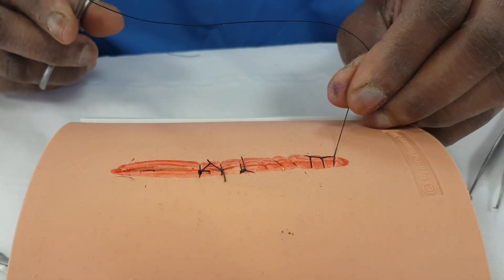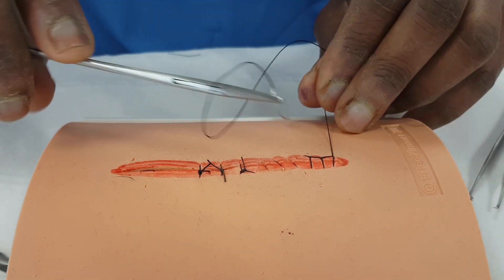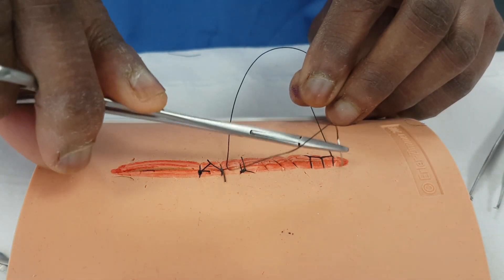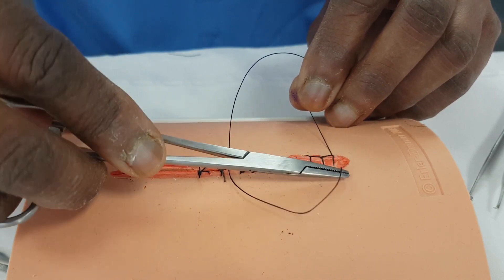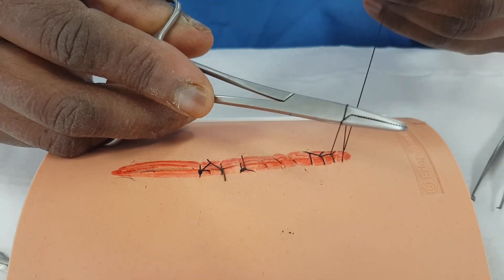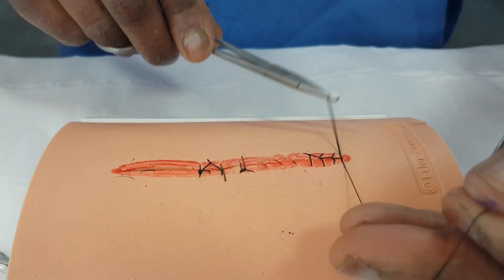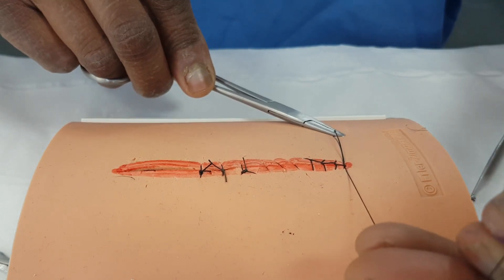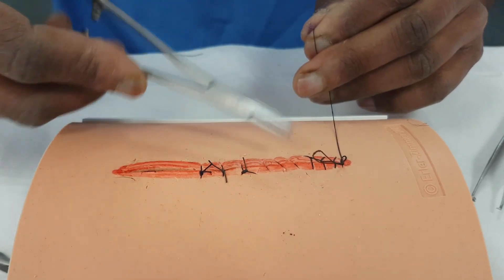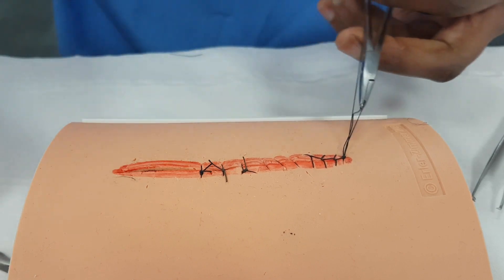So now what we've got to do — we've finished the end of our suture line. We want to tie everything off. To tie this off, I've only got one end, so I've now got to make another end that's separate. The way to do that is to come through the stitch like this, and now I've got two ends. All I've got to do is tie my two ends exactly as I did before with my suture. It's done. So I've cut that off.